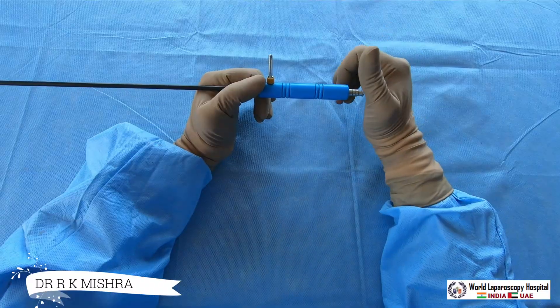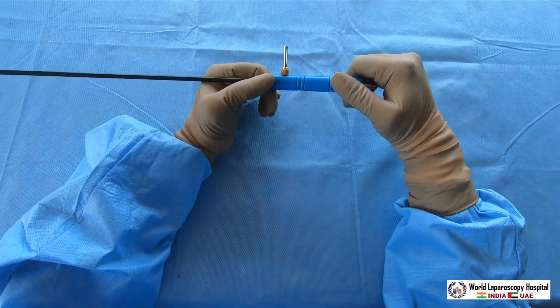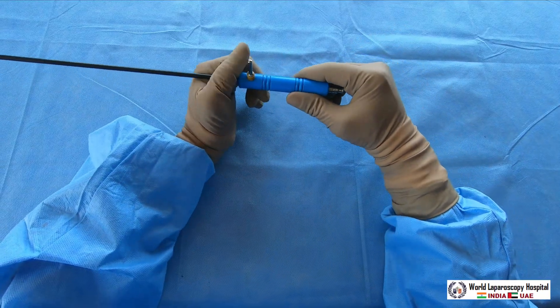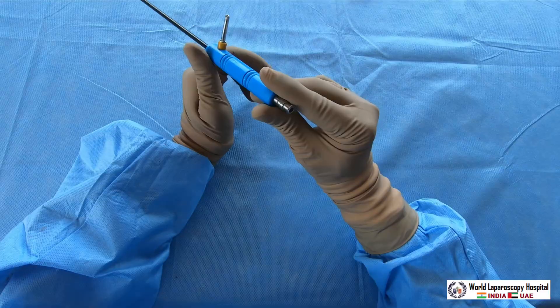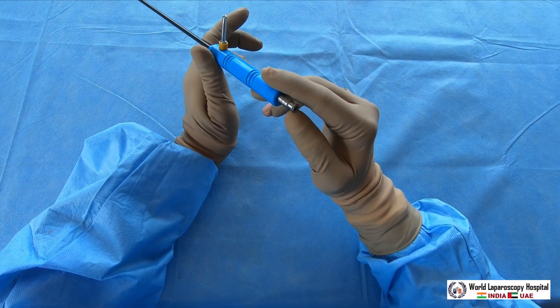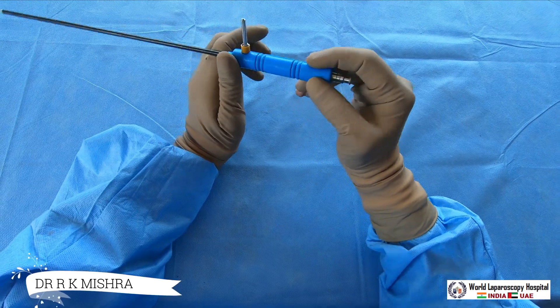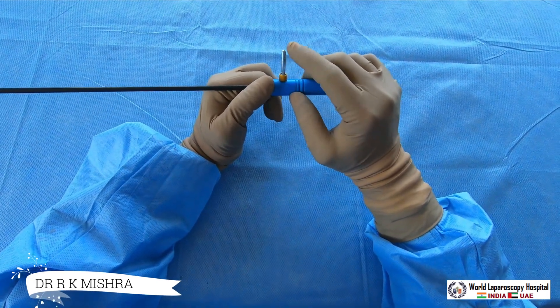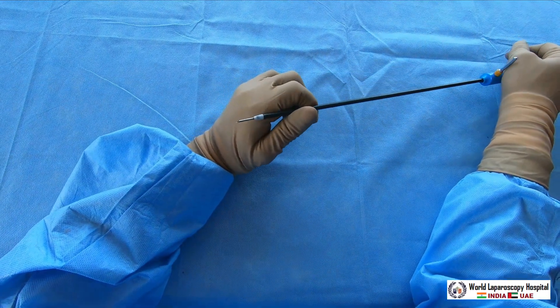The same aspiration needle is also used sometimes in an edematous or mucocele of the gallbladder. Some surgeons routinely aspirate it so that if the gallbladder is deflated, surgery will be easier. You can attach a syringe to aspirate the fluid, or you can attach the luer lock of your suction to aspirate all the fluid.